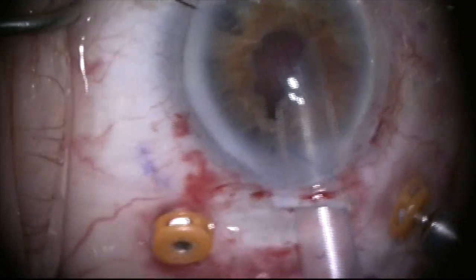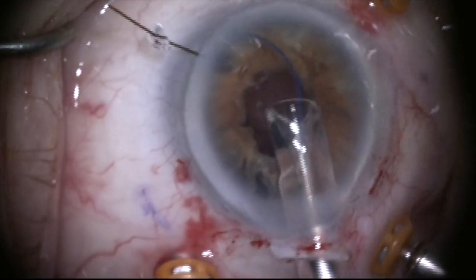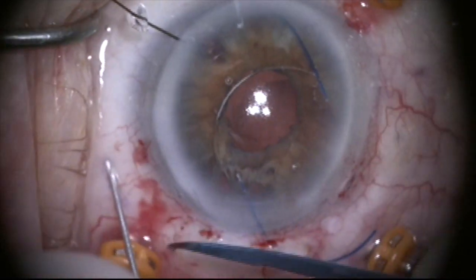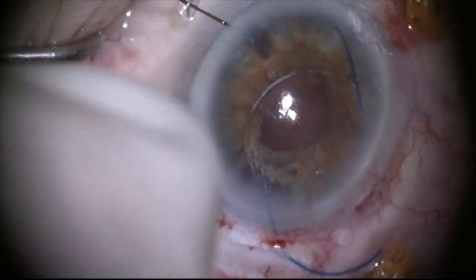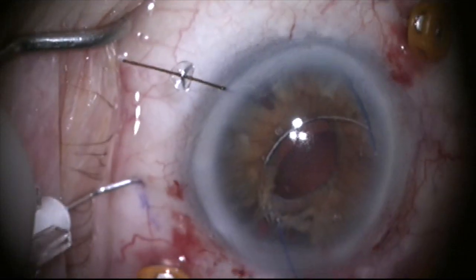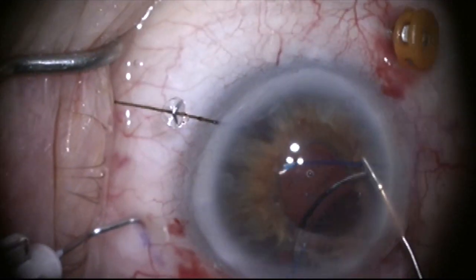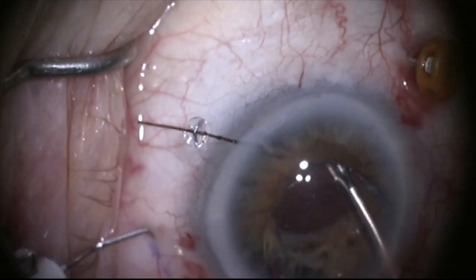Now we're going to inject a Zeiss 602 lens into the anterior chamber for Yamane intrascleral haptic fixation. The lens is placed into the anterior chamber, and I take a 30-gauge TSK wide-bore needle two millimeters closer to the limbus. With my left hand I make a tunnel and enter under the iris with the needle, then grab the haptic with the forceps and tuck it into the 30-gauge needle, which will secure that haptic.